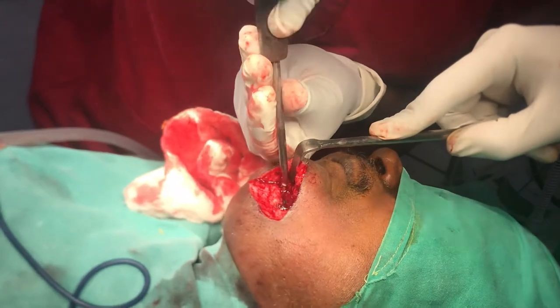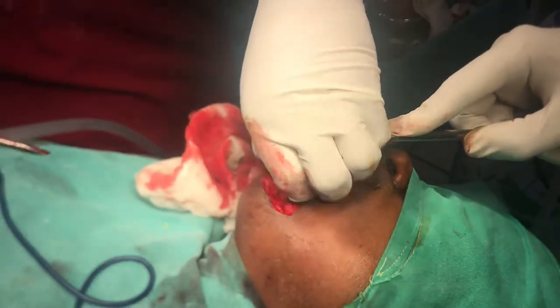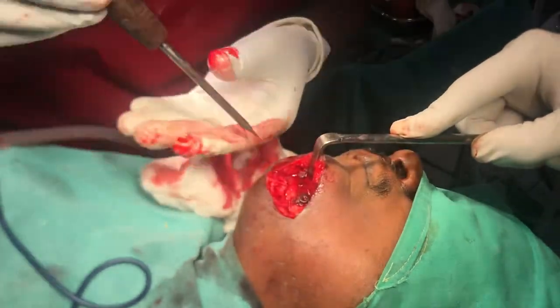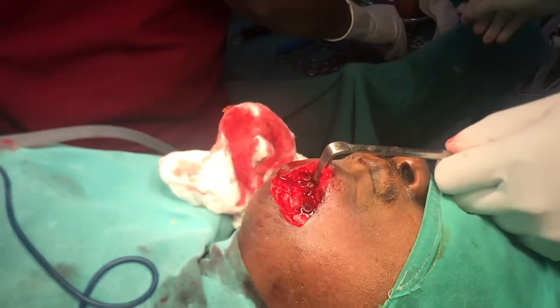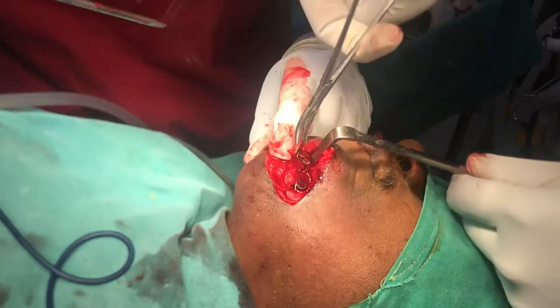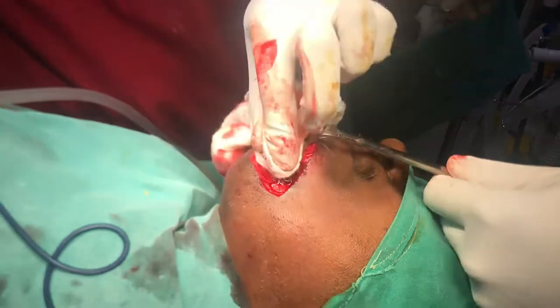It only takes four weeks for the bone to fuse after a fracture. So it's not a bad thing that these implants are coming off, because it's about 12 weeks now — the job that these plates and screws had to do is over. We're doing this under local anesthesia.